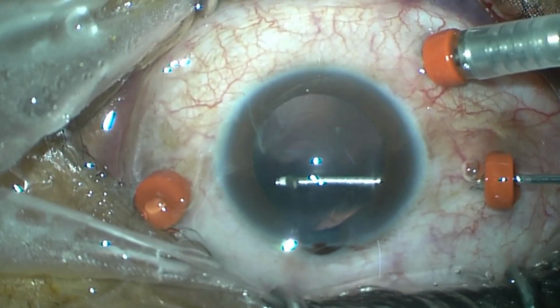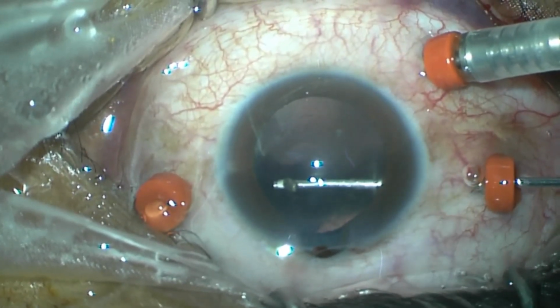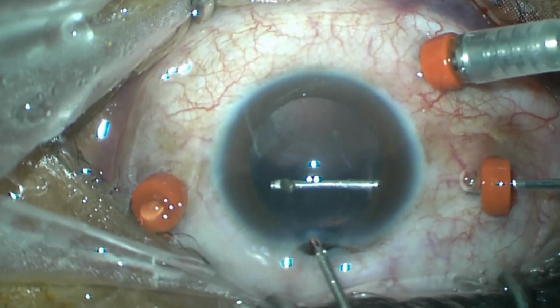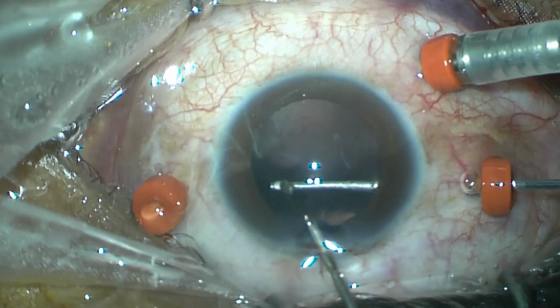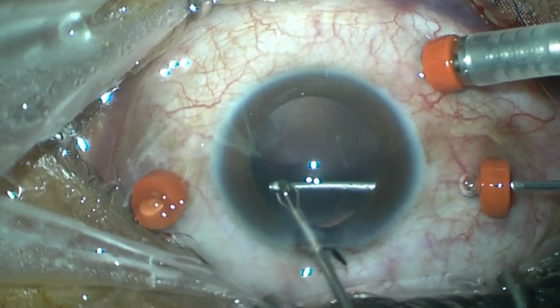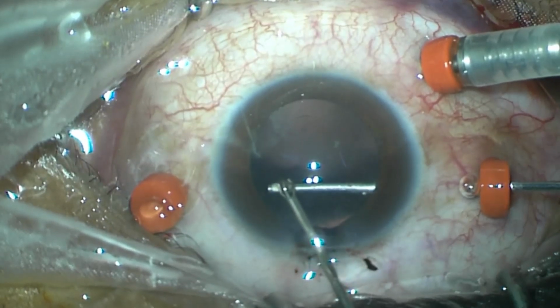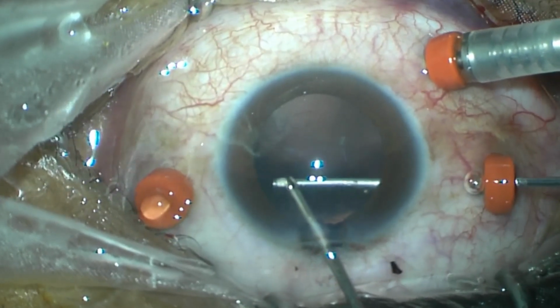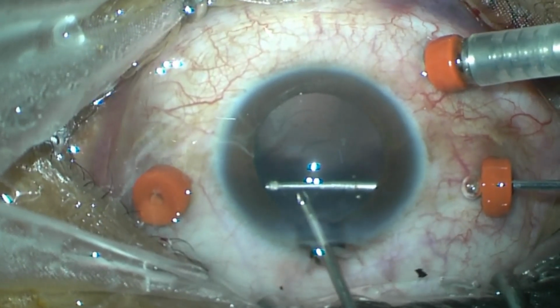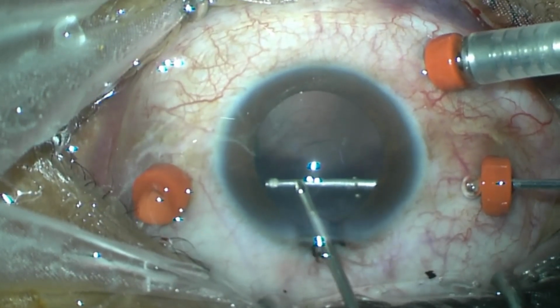The advantage of this technique would be that we will not have to hunt for the foreign body, which would get lost if it falls down. Although that is also a preferred technique, this makes it more practical and straightforward. The foreign body has been grasped, and now it can be simply pulled out of the incision.